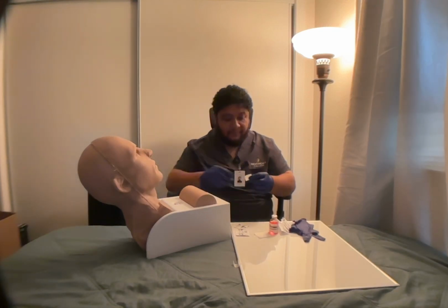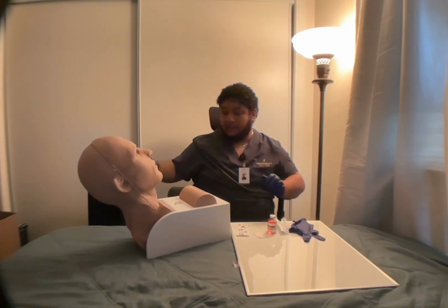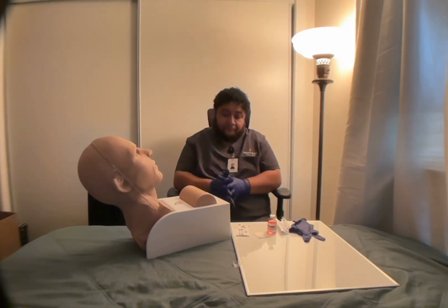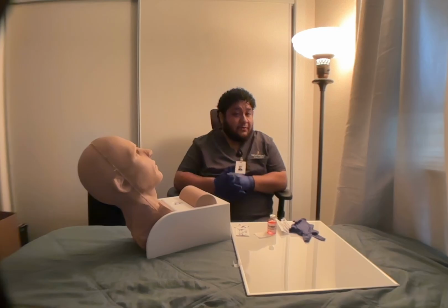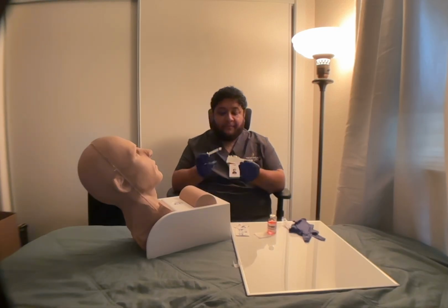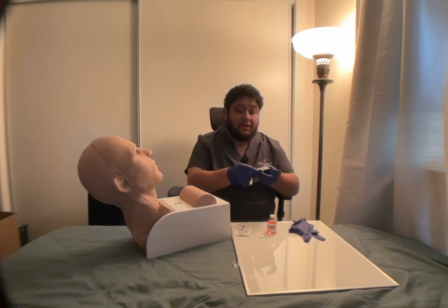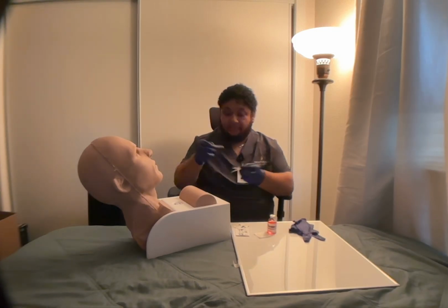Toss this in the trash. Discard of this. Okay, now I'm gonna select the correct syringe. So here's my 3 milliliter syringe. Toss this in the trash. And here's my 22 gauge 1-inch needle. Toss this in the trash.